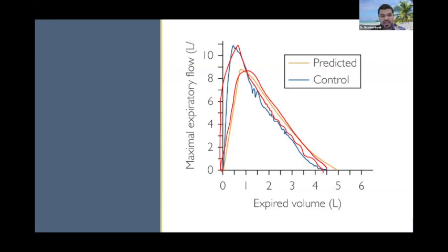Again, actively engaged, try to think for yourself. What do you think this is? Let me clear it a little bit. This is actually normal. Sorry, I know it sounds like a trick, but there's a lot of different normal shapes, and that's something that we'll just have to agree with.